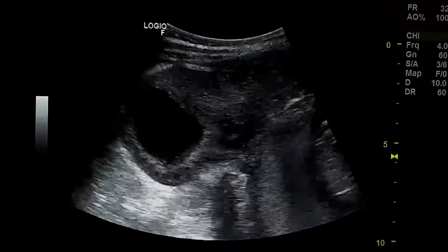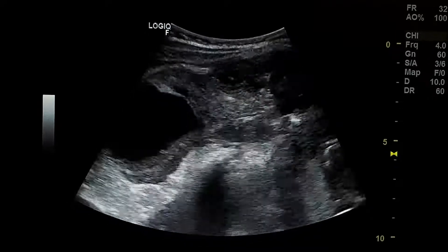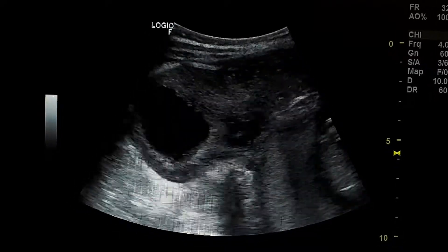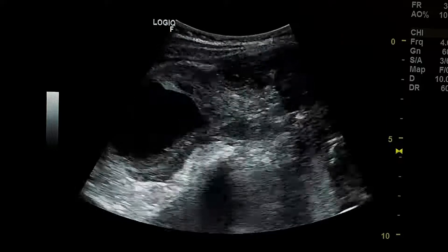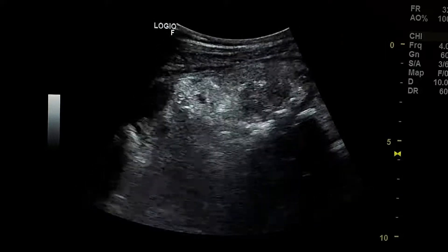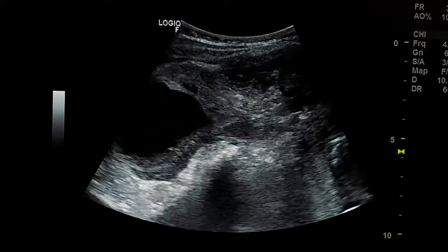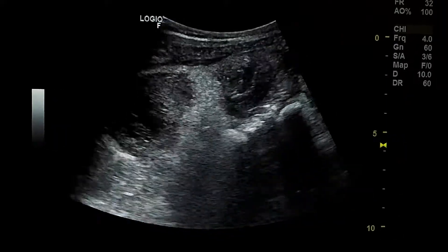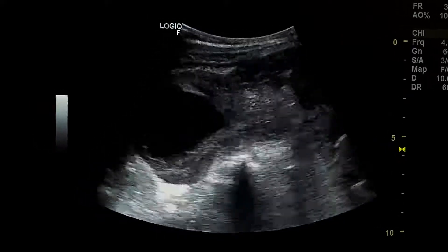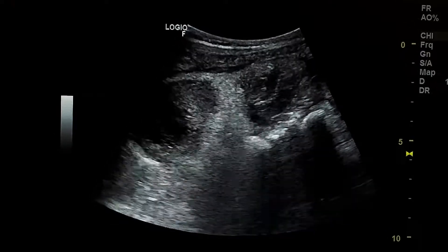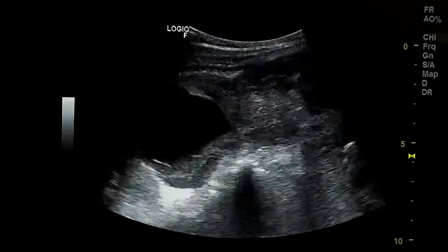This is a case of left ovarian torsion in a pregnant woman, age 29 years, pregnancy about 20 weeks.